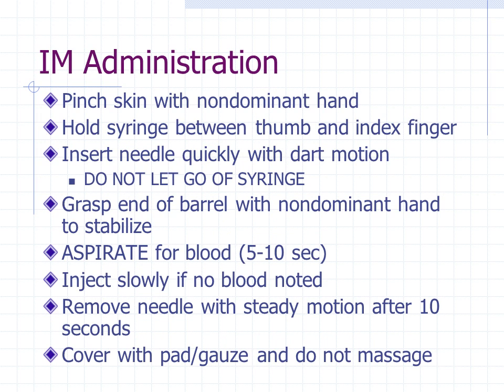With IM administration, pinch up that skin, again holding the syringe between the thumb and index finger, and inject quickly with a dart-like motion. Don't let go of the syringe. You stabilize the barrel of the syringe with your non-dominant hand. Aspirate for blood and then inject.